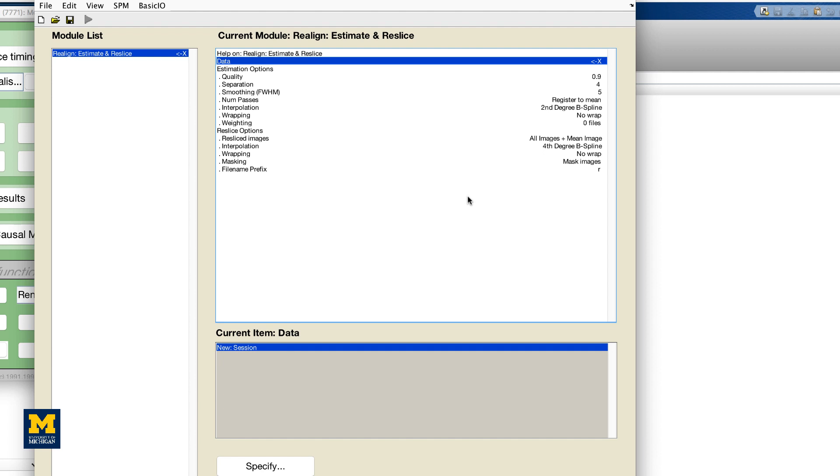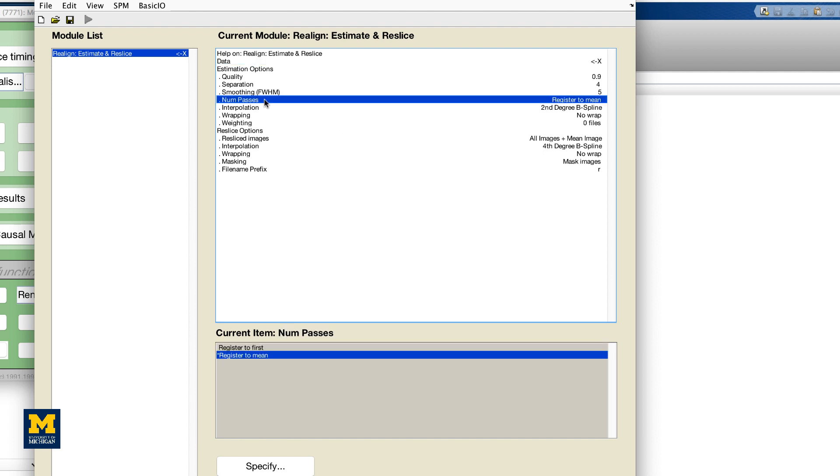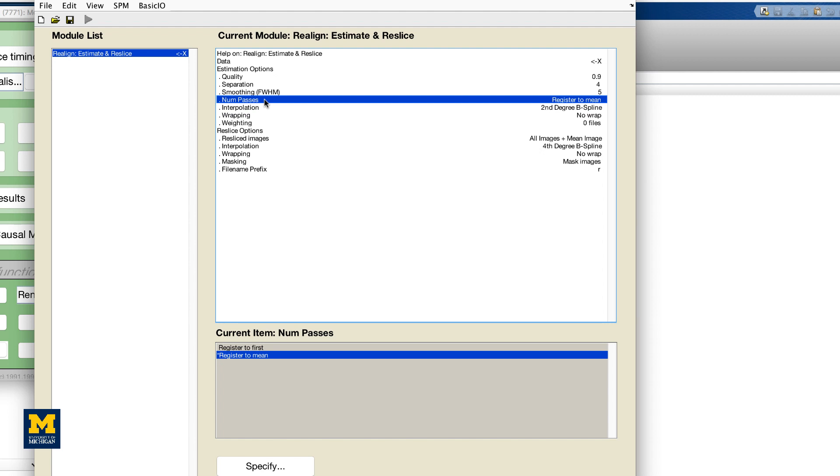The reference volume is set in the field NumPasses, which allows you to specify whether the volumes will be aligned to the mean of all the volumes or to the first volume. For this tutorial, leave it as default and leave the rest of the defaults alone as well.